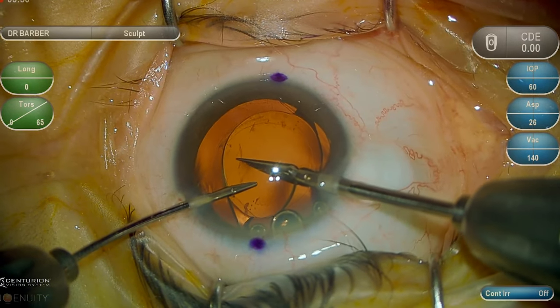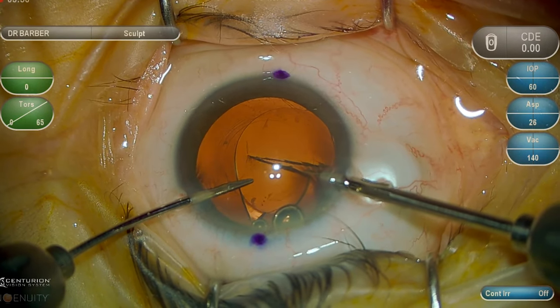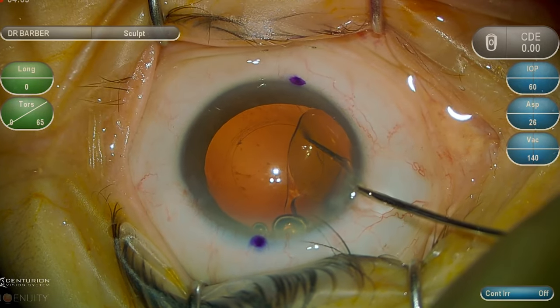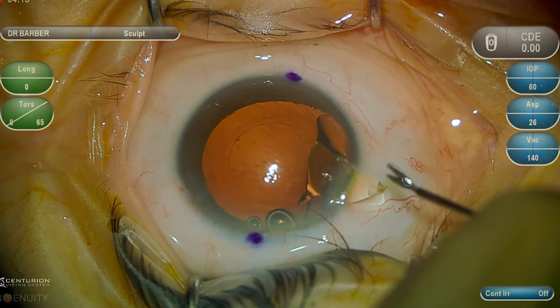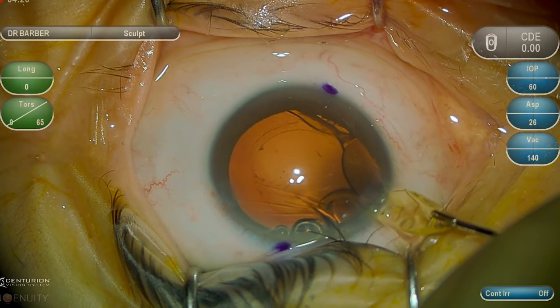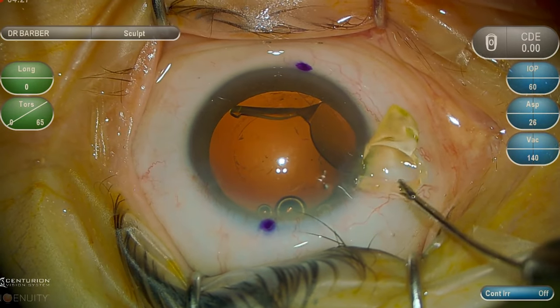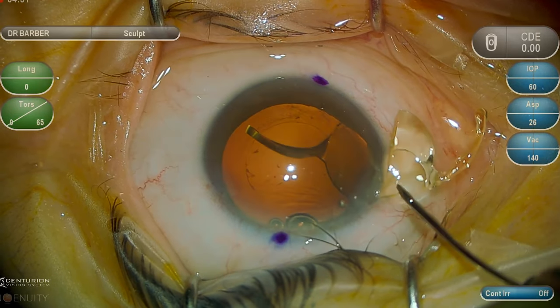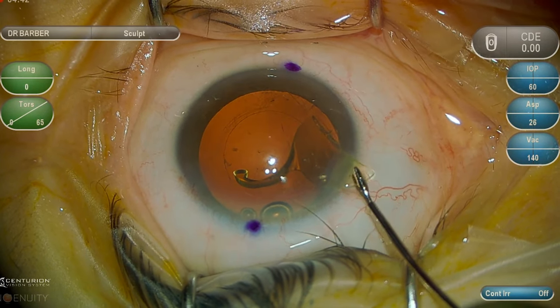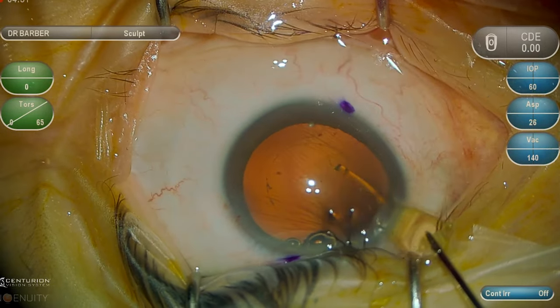Then, grabbing the proximal corner of the first hemisphere of the lens implant and externalizing it through the primary corneal incision. Again, paying careful attention to the terminal bulbs of the haptics to make sure that they are not fibrosed into the peripheral aspects of the capsule. Once the first part of the lens implant is removed, it will typically self-amputate, and then the second hemisphere is already presented in the incision and can be easily removed in a relatively atraumatic fashion.